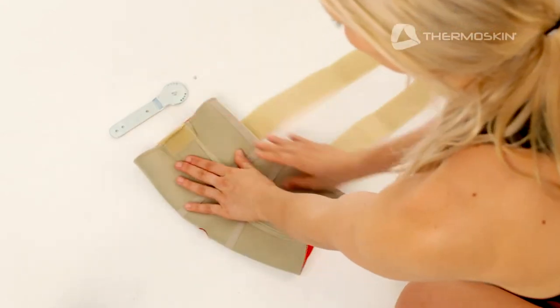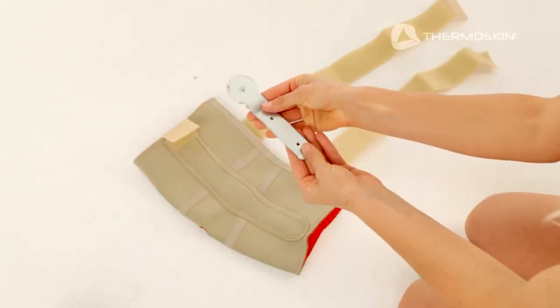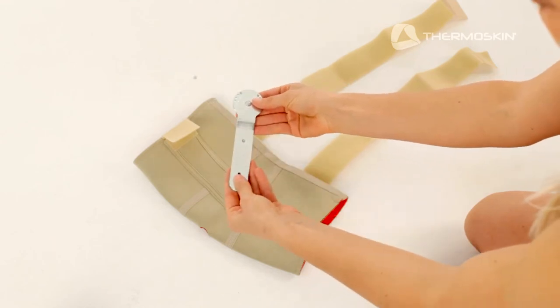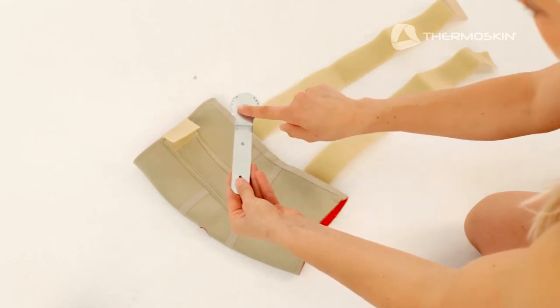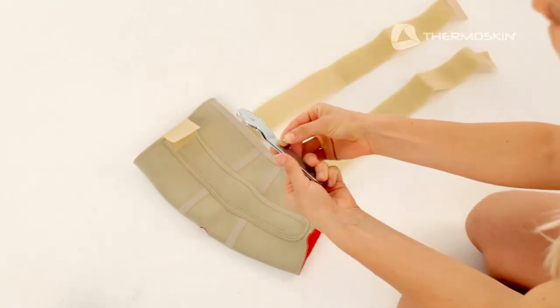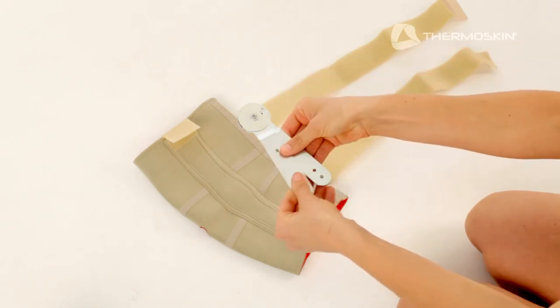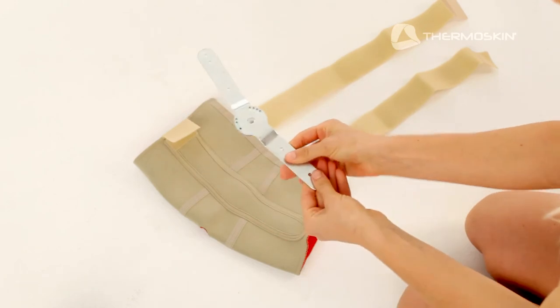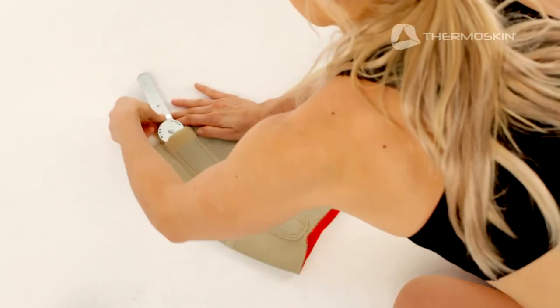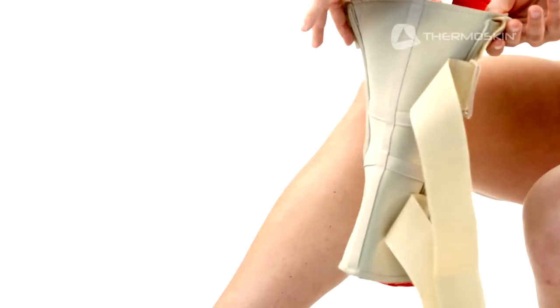To fit the knee brace, undo all the fastener straps. For this video we will use the range of motion hinge. Range of motion hinges need to be set to the required degree of movement before inserting them into the brace: either 0, 15, 30, or 45 degrees. To do this, simply position the removable pin in the required degree of movement. Set both the right and left hinges to the same degree and insert them into the side pockets of the brace, securing the short fastener straps at the top to keep them in place.